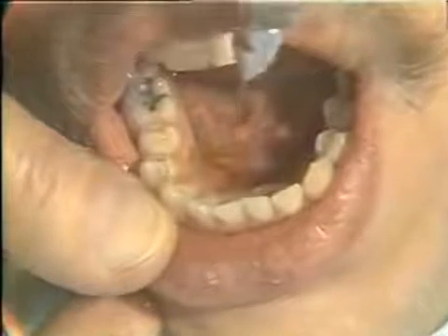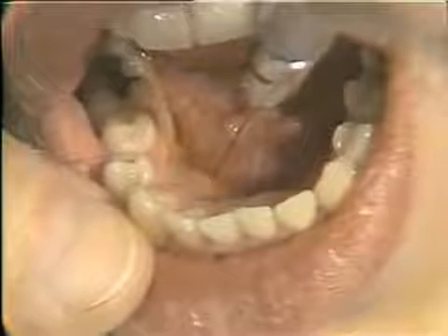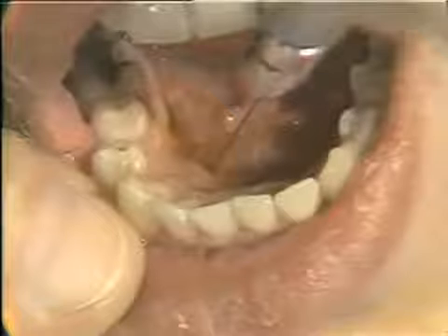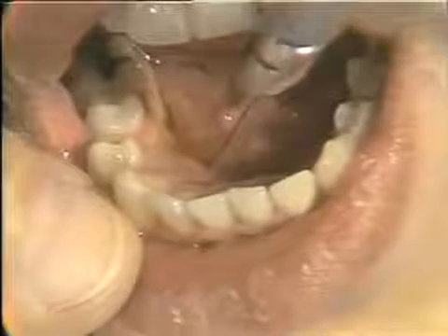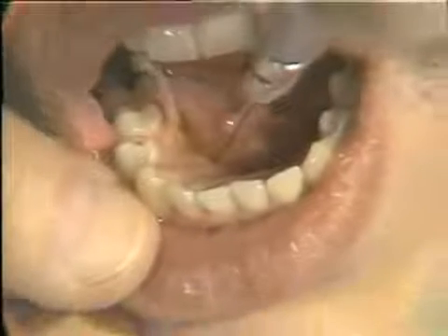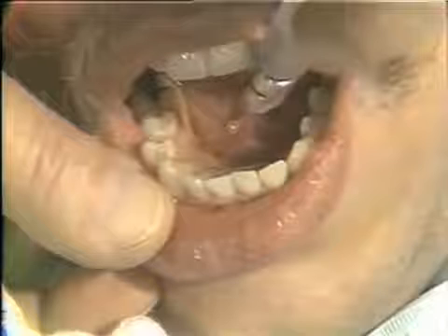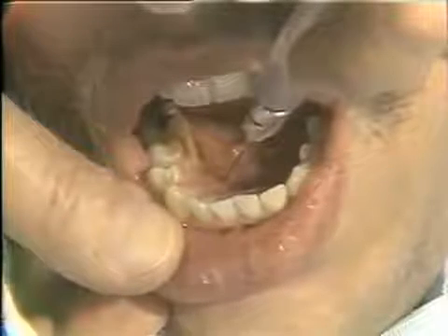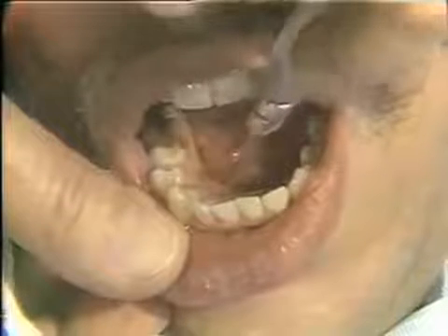And then we come in with our syringe at about this angle, make our penetration, and just carry our needle bevel a few millimeters, 2 or 3 millimeters below the surface of the mucosa. And I am aspirating now. Everything's fine. And very slowly we'll inject about a half a cc of solution in this site, and this will very adequately anesthetize these lingual soft tissues adjacent to the cuspid.